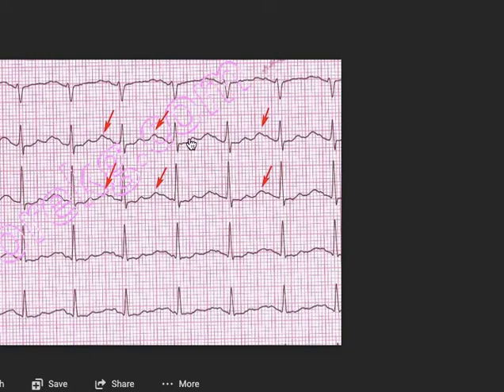But sometimes in sinus bradycardia, we can see U waves as well. Sometimes when the patient is on some anti-arrhythmic drugs, we can see U waves. And sometimes these U waves can be inverted, or negative U waves can be seen, like in myocardial infarction. So that's it. There is nothing more important than that for this one.